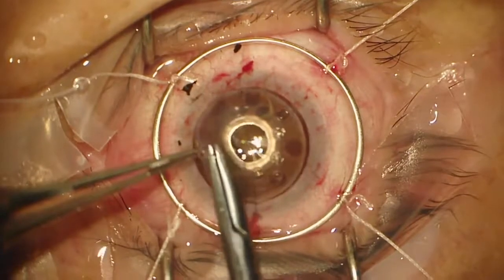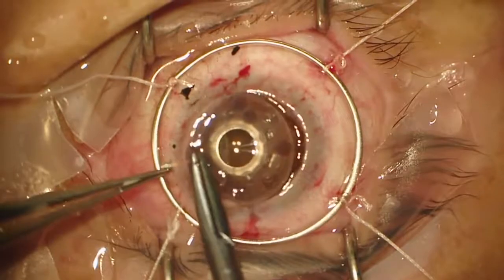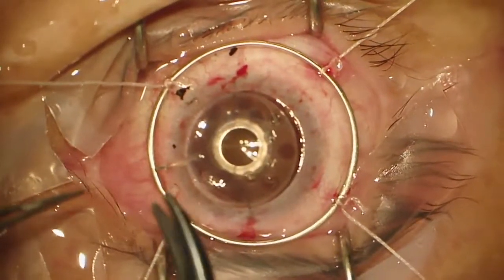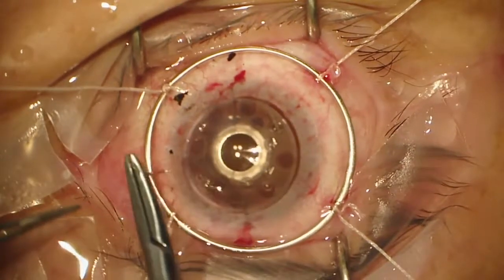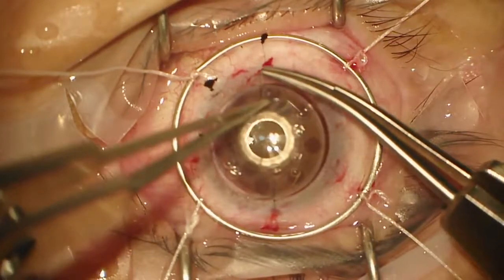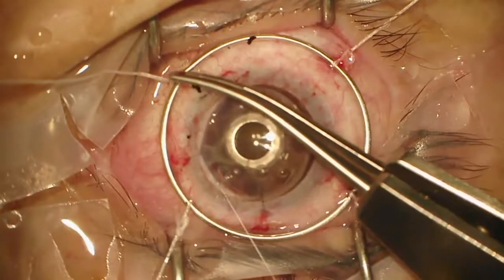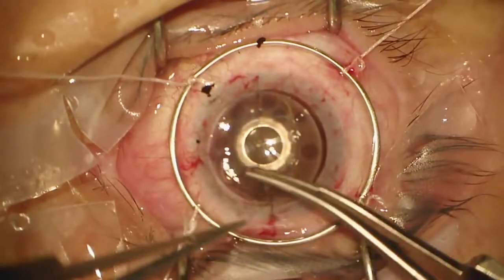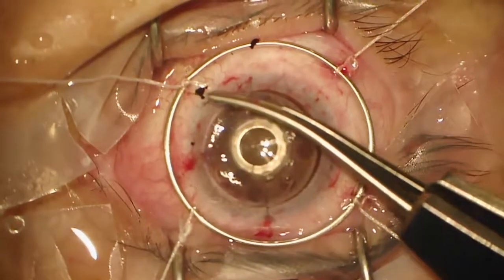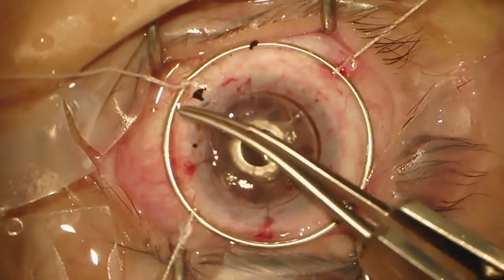Okay, so that changed our plan a little bit. Because of the posterior pressure, I'm going to put in the straight point 1-2, please. The 4 cardinal sutures, then we'll look to the peripheral iridectomy after that. In a situation in which you have posterior pressure like this, it's important to repressurize the chamber as your first responsibility. Then you can go back and do the regular steps in the procedure.